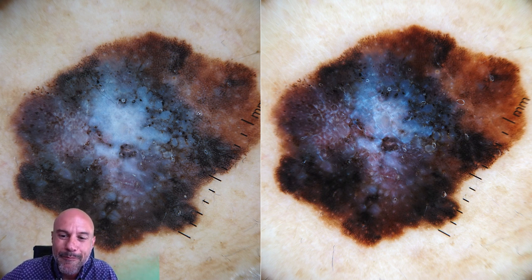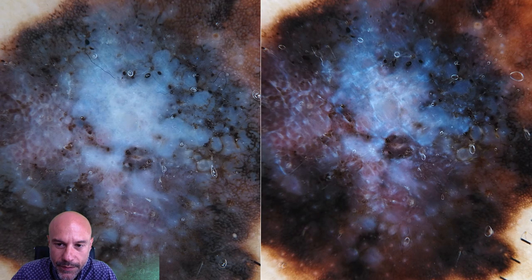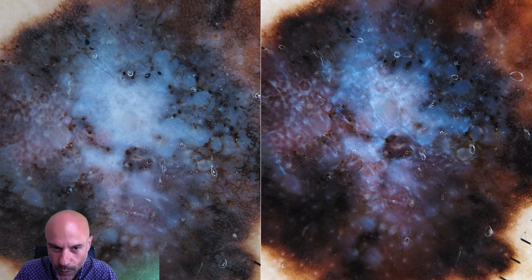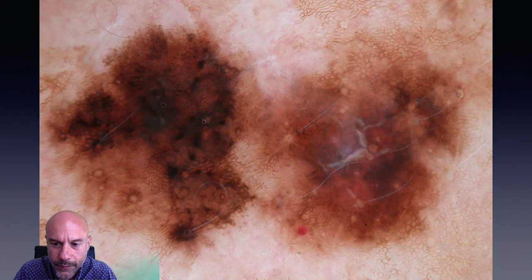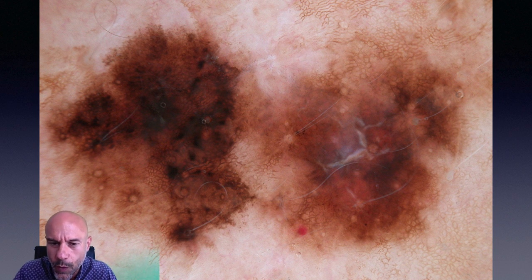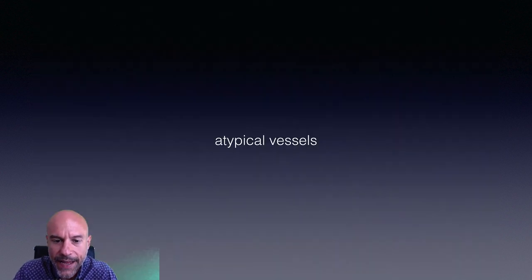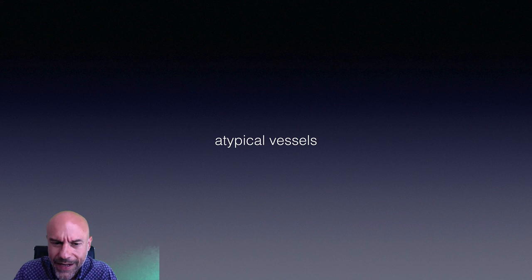Here again with magnification you can see the difference between polarized and non-polarized light for white shiny streaks, with one more example of these white shiny streaks.